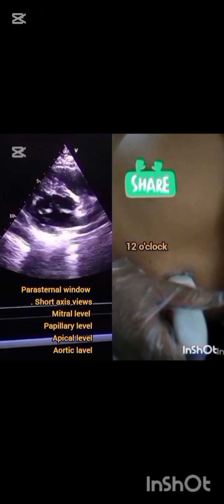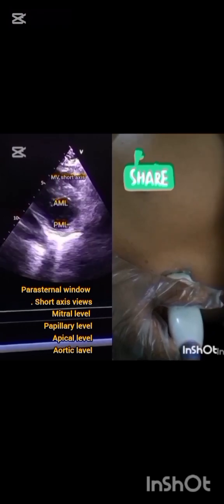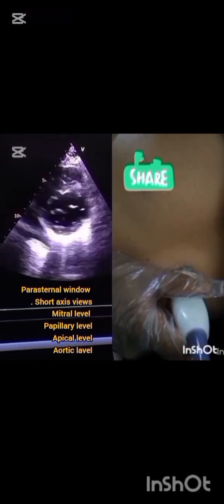Parasternal short axis view. Short axis views are made by rotating the probe by 90 degrees toward the chin from the right shoulder, from 11 o'clock to 12 o'clock. Short axis views usually include four different views. Mitral level. In this level, you see the mitral valve and calculate the mitral valve area.